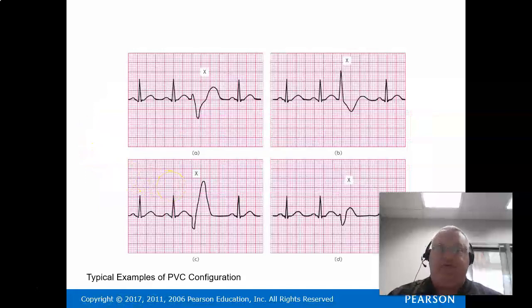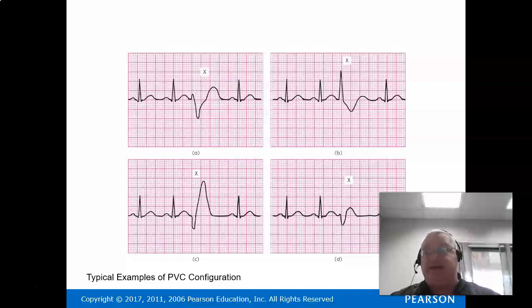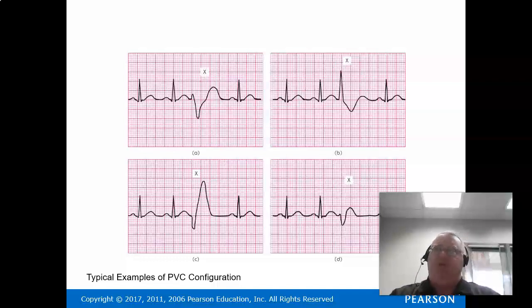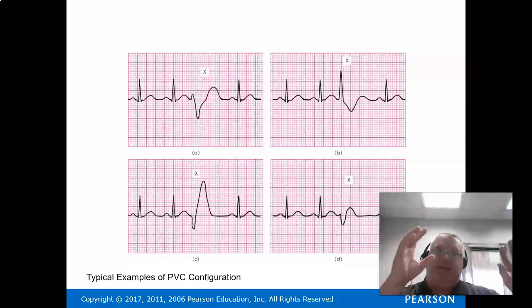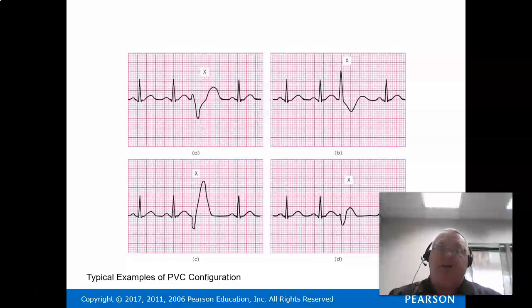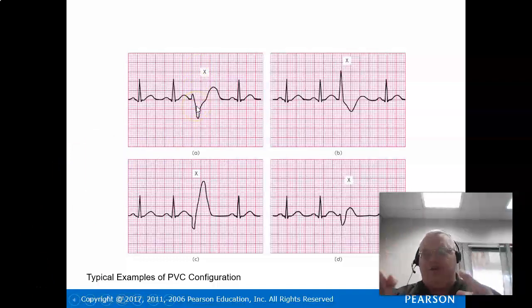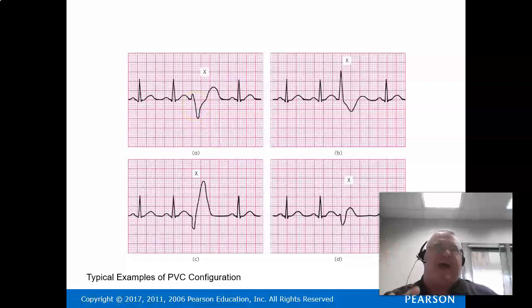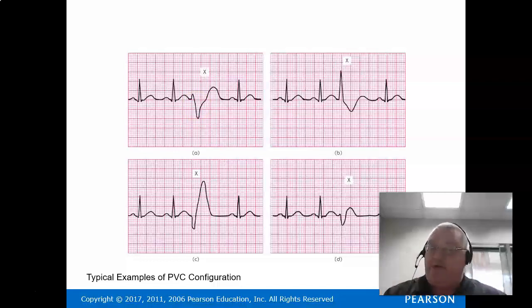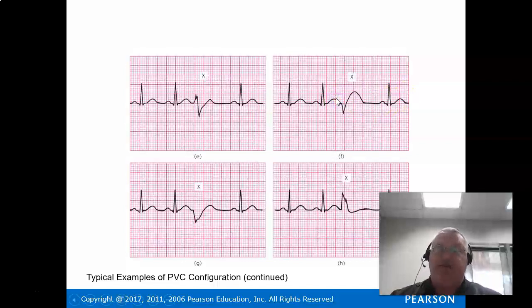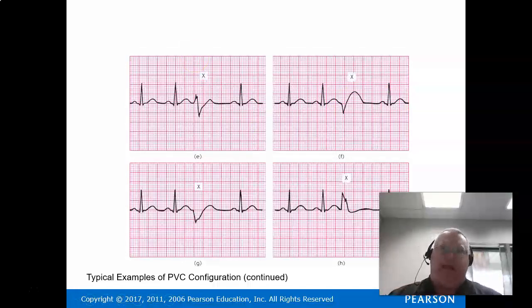PVCs can look way different from the standard complex — that's the key to identifying them. A PAC or PJC will pretty much have the same QRS as the normal beats, since it's still going through the AV junction. But a PVC starts in a different location, somewhere in the lower part of the heart. That lower tissue is fatter, therefore it produces a fatter, wider EKG wave.